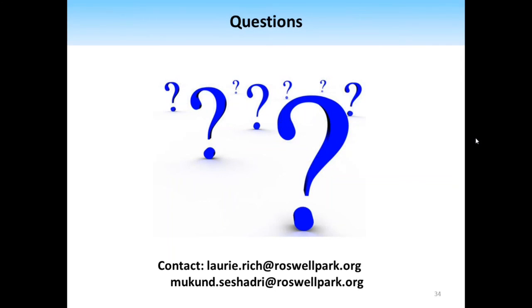But if you go to the radiology paper from 2015, we actually did compare to contrast-enhanced ultrasound. And again, we did our photoacoustic and contrast-enhanced ultrasound before and after treatment with our VDA. And what was really nice to see is that spatially we saw a good agreement between the two imaging techniques, which you would hope. And after treatment, we again saw that areas which lost signal with photoacoustic imaging also changed with our contrast-enhanced ultrasound. So we did validate with that. That's in the supplementary figures of that paper, but that was just a small study where we compared, and we did see some nice spatial correlation between those two methods.